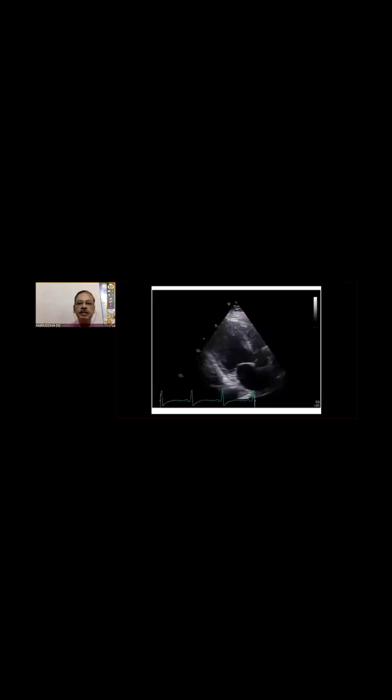Another is asymmetrical septal hypertrophy. The same thing you can say. In this case, see the septum is hypertrophic, and the posterior wall is absolutely normal. The other walls are relatively normal. No intracavitary gradient, but you can see that starting from the base to the apex, the whole anteroseptal GLS is grossly reduced, and overall GLS is minus 7.8%, but here it is only 3 to 4%.